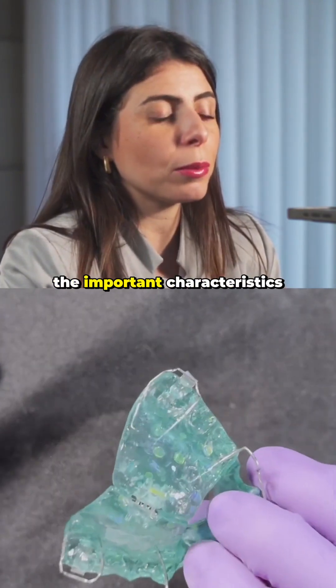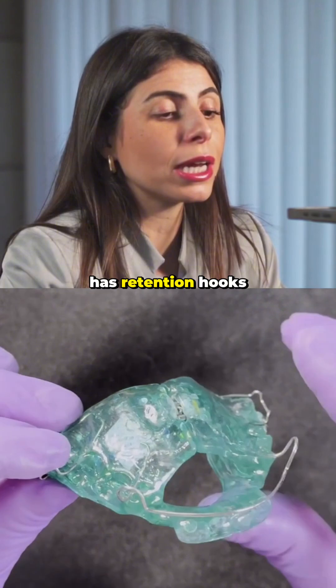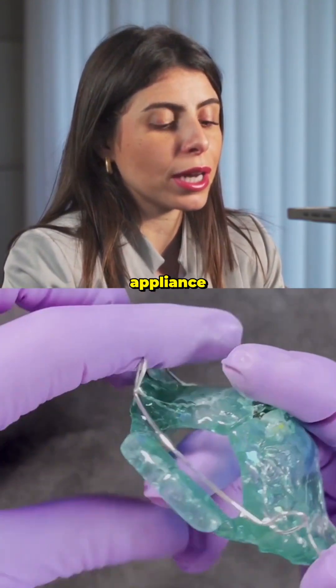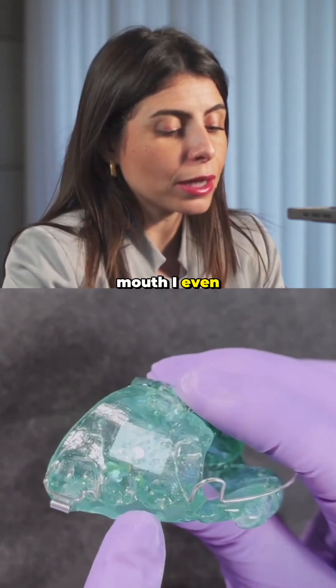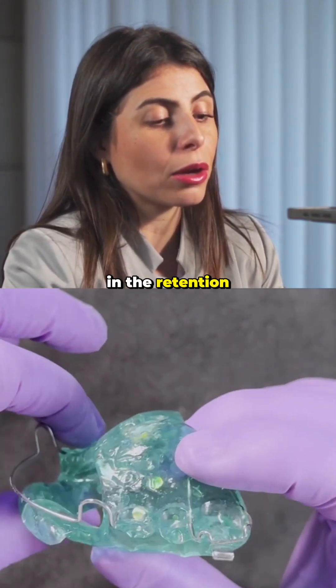What are the important characteristics? Number one: this appliance always has retention hooks. I need these retention hooks to hold the appliance in the patient's mouth. I also like them to have small drop-shaped hooks in this area, which further aid in the retention of the appliance.